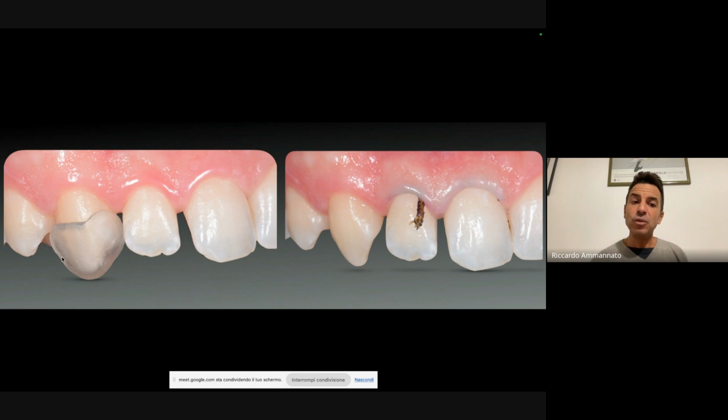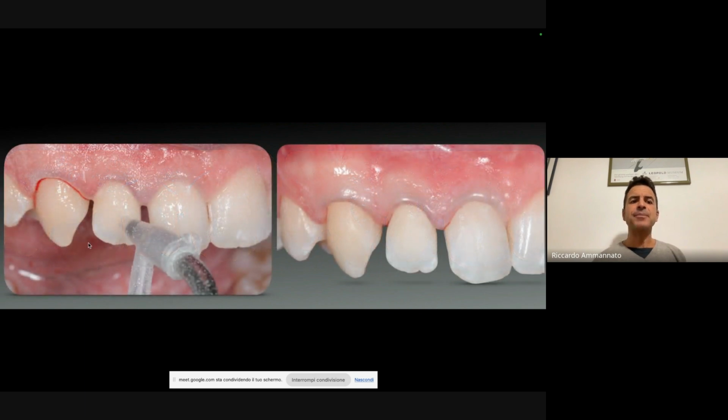We are also using, and we'll see this later on, 3D printed indexes. Conventional ones, like in this case, we use both the silicone ones plus the 3D printed ones. Okay, here I'm checking the interproximal on the upper canine.